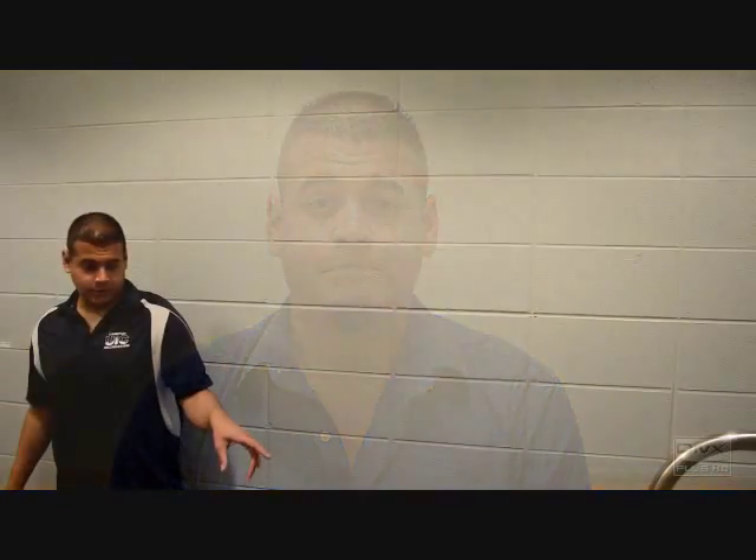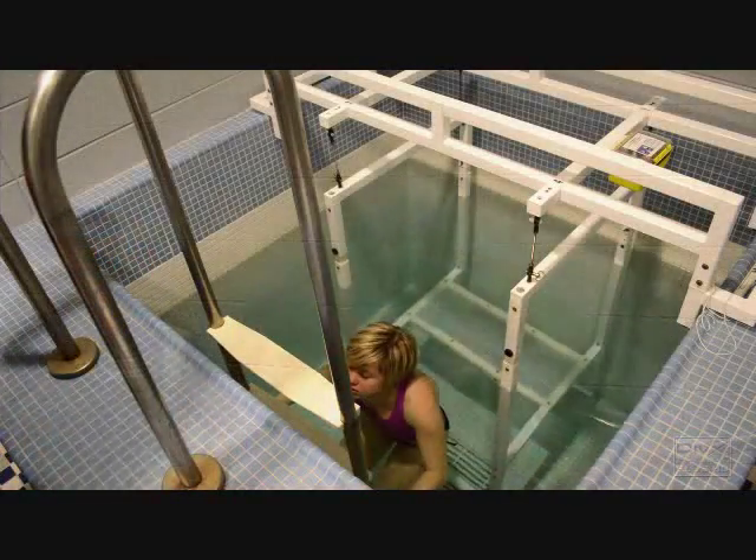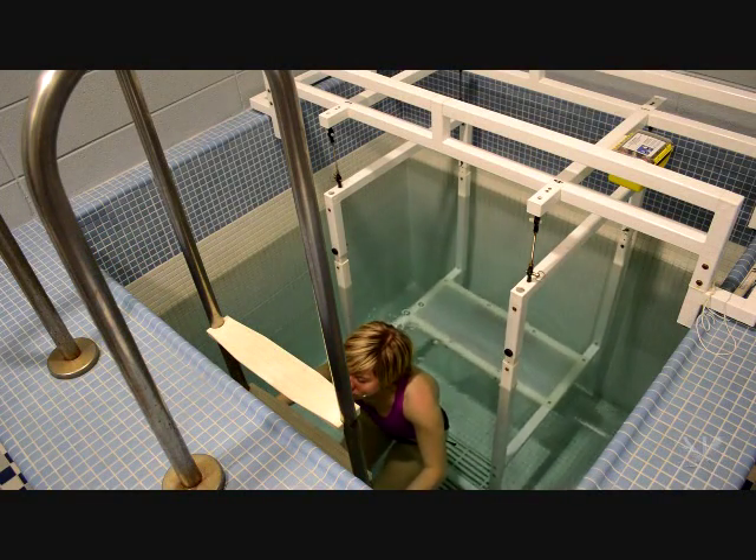Initially you would do one hydrostatic weighing today and then three to six months from now do another test to see exactly where you're going. So what I need you to do is just stand in front of the ladder for now. I'll have you hold stuff. Right now I'm going to re-zero the scale and we're all set.